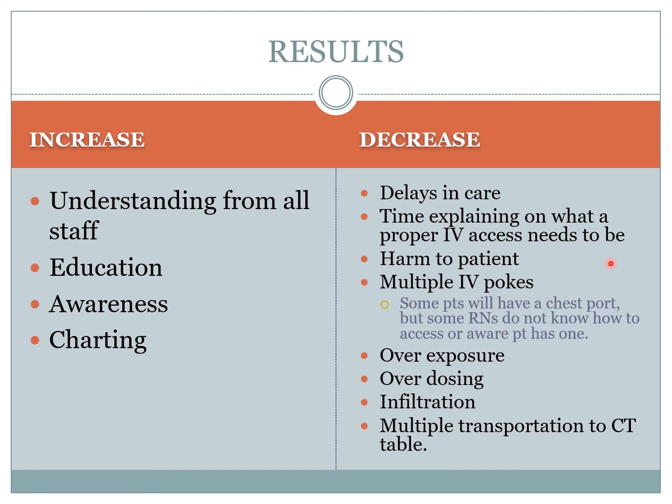Because sometimes a doctor or physician will come to the CT department and wonder what's taking so long, why haven't we scanned the patient yet? And this is because there's a delay in IV. There may be a 22 gauge IV access, but we are not able to use a 22. We need a bigger gauge.